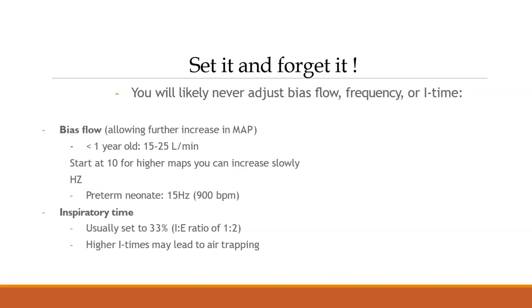Okay, hertz. This is written a little funny, sorry. So we set it at 15, which is 900 breaths per minute. We never, ever, ever change it from 15. You just leave it there forever and ever. There are a couple super rare times when we might take it down, but it's almost never done.